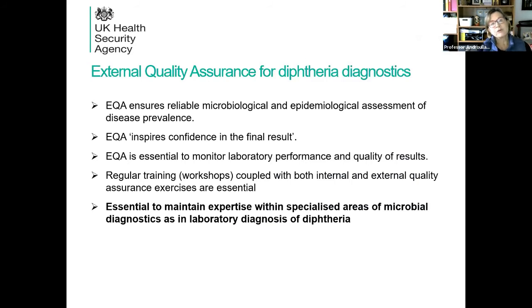So why is it important for diphtheria diagnostics? I think it's quite obvious. It ensures the reliability, obviously, of the results and the epidemiological assessment of disease prevalence. It's essential to monitor lab performance and the quality of results. And it's also important to have regular training workshops coupled with EQA, as it is really important to maintain expertise within these very specialized areas of microbiology.